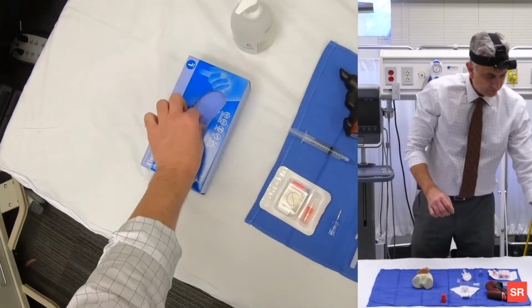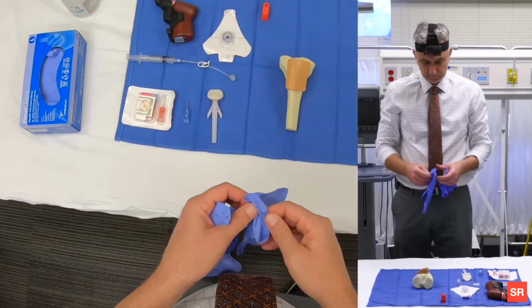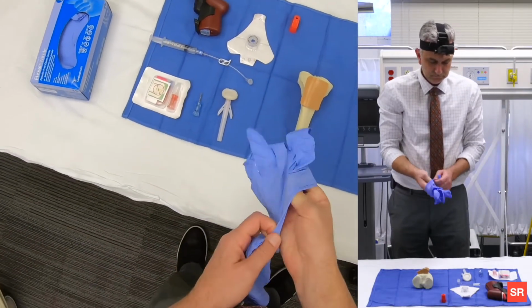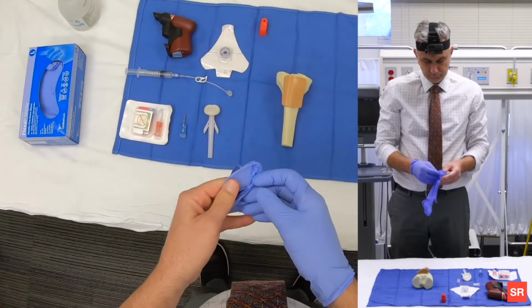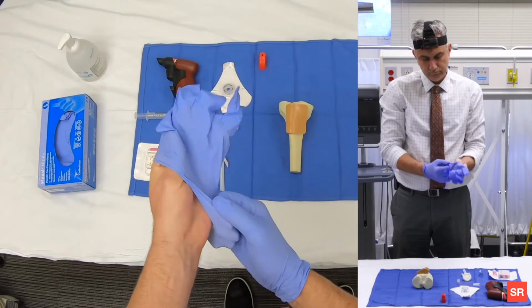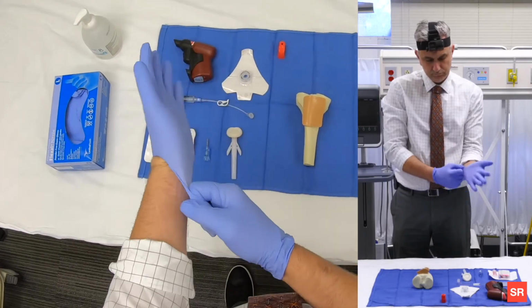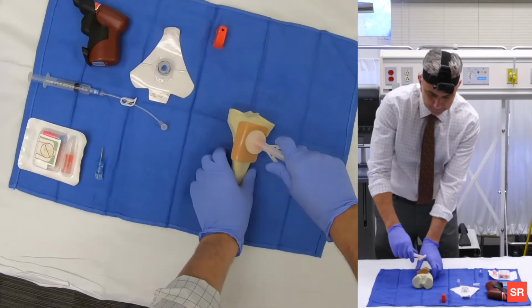At this point, I'm going to put on some gloves. And I'm going to cleanse the site with ChloraPrep.